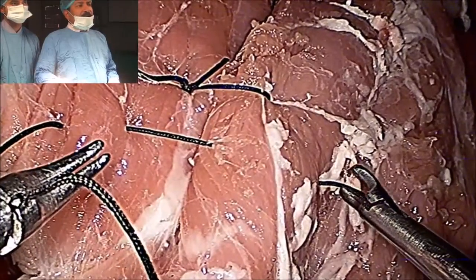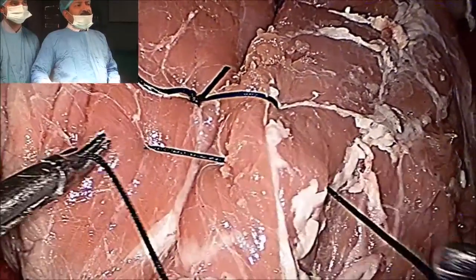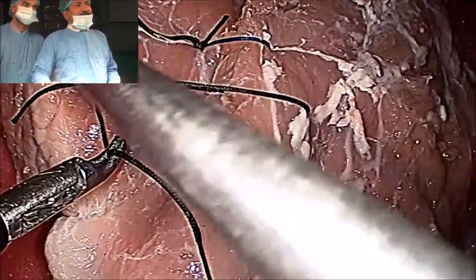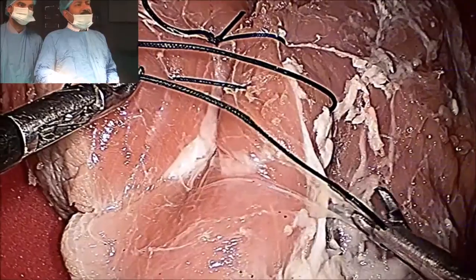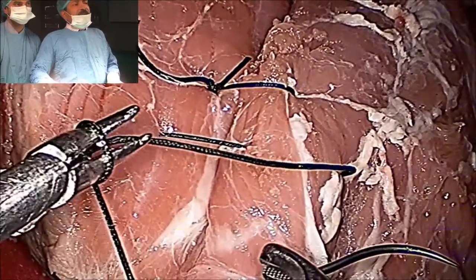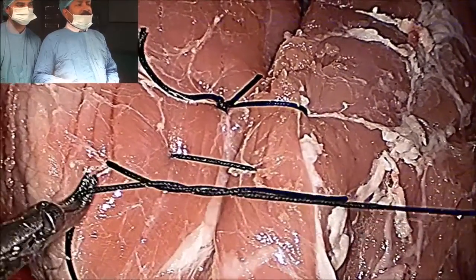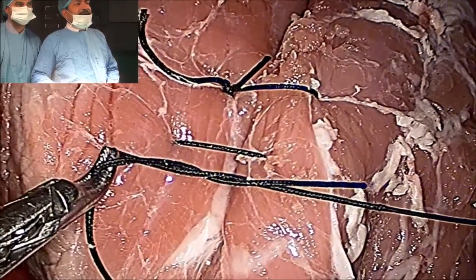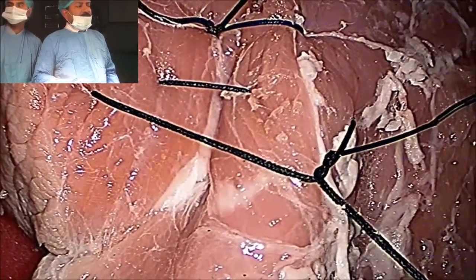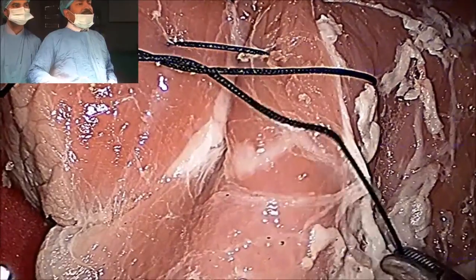The first requirement of the tumble square knot is that the tail should be 2 cm bigger than the defect. So if the defect is 4 cm, the tail should be 6 cm — this way you will measure. After that you will make a shape of a C, and this is one half knot taken. After taking the half knot, you will catch the tail and keep it loose — you will not tie it. Take care that the knot should be towards the left, not towards the right, because you have to slide the knot on that long end.